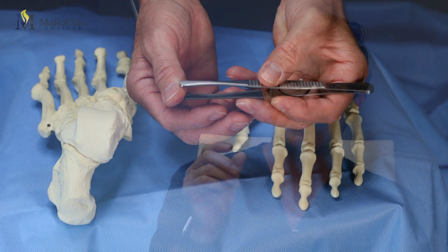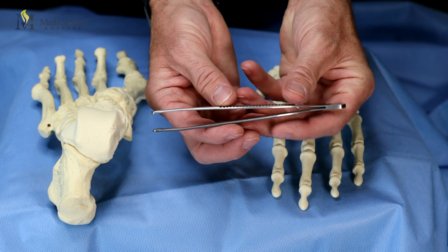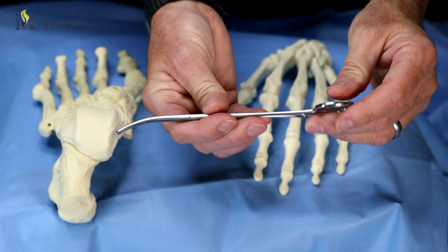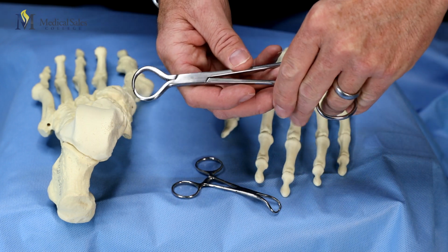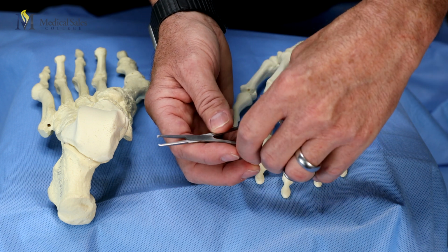Forceps, and a forceps is used for grasping as an extension of one's fingers to pick up or grasp soft tissue and or bone. Clamps are used in the operating room to secure or clamp drapes and or towels, as well as clamping or ligating vessels or other types of soft tissue.